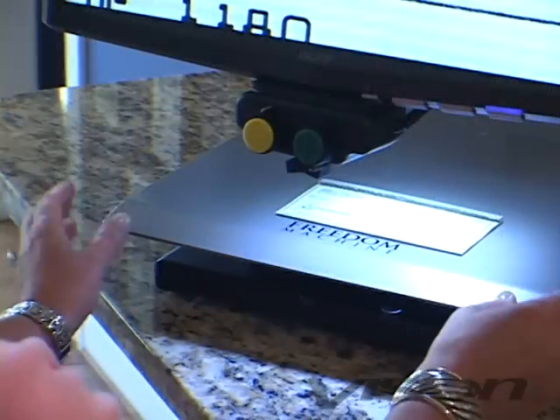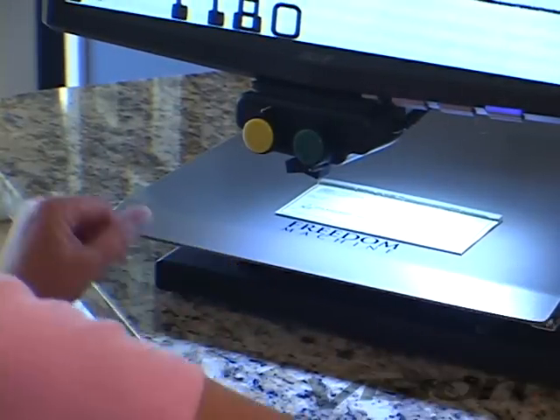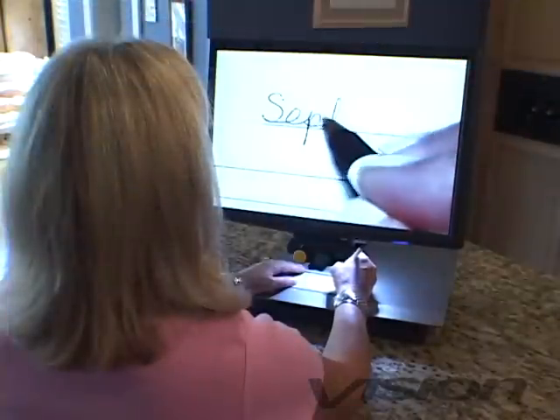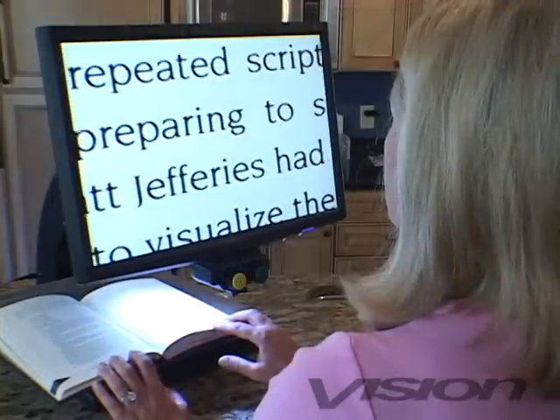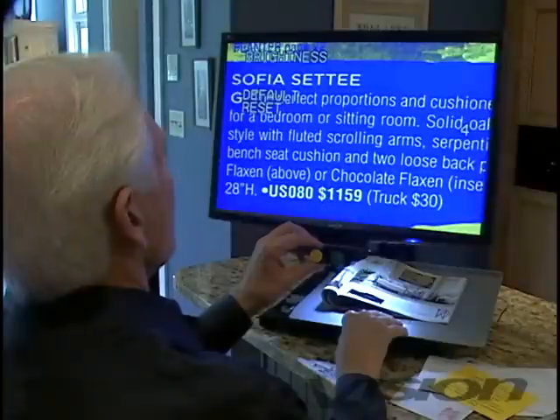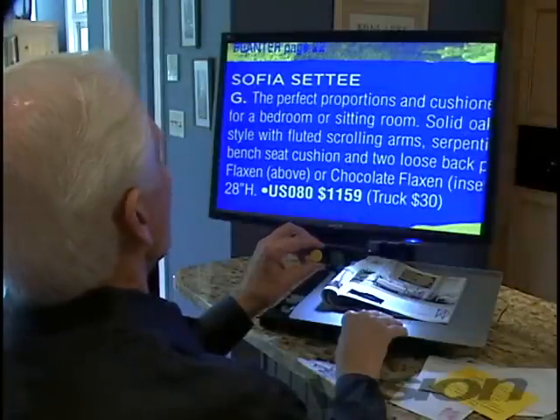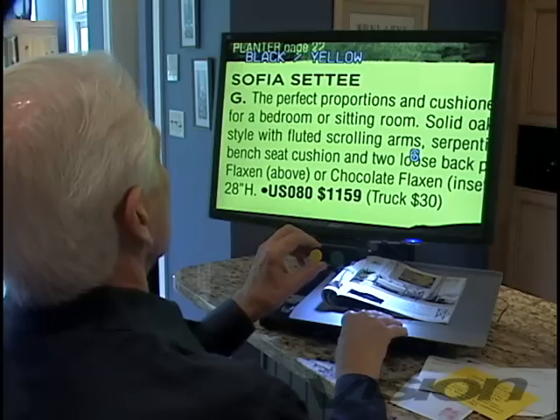The smooth gliding XY table is both a large reading platform and stable surface for writing. Magnification can be adjusted to the actual document you're viewing. Freedom Machine has 12 enhanced contrast modes making it easier to read.